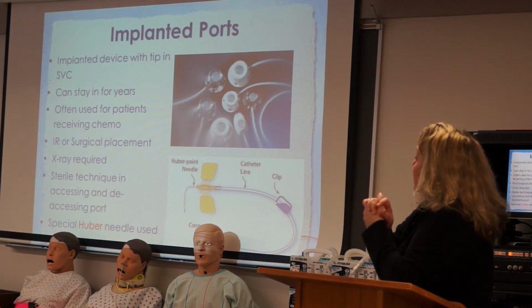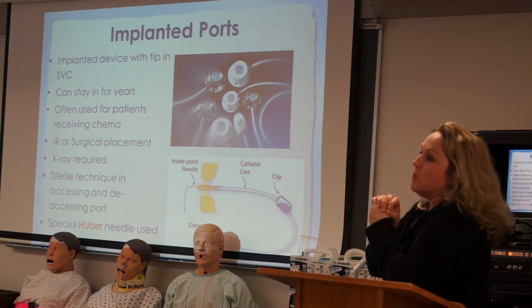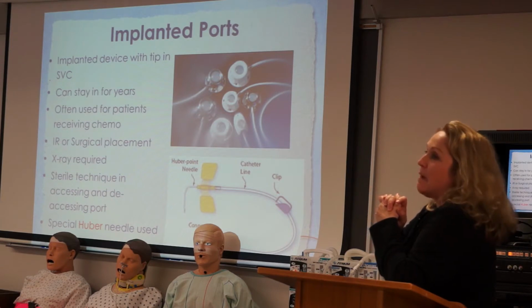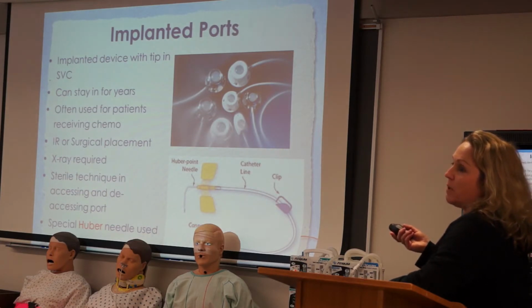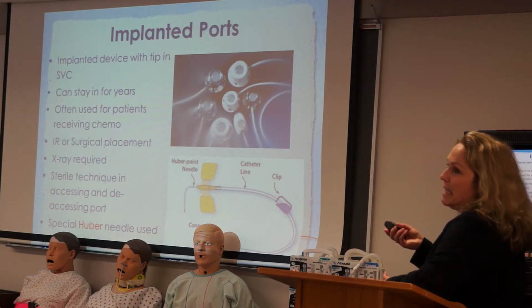These are really nice to use, but sometimes when you put those needles in, it can be difficult. Sometimes you hit sideways and you don't get blood back. So you really do have to be trained on how to put these needles in and how to take them out as well. Ports have to be heparinized when they're not in use, just like all central lines for the most part, depending on facility policy.